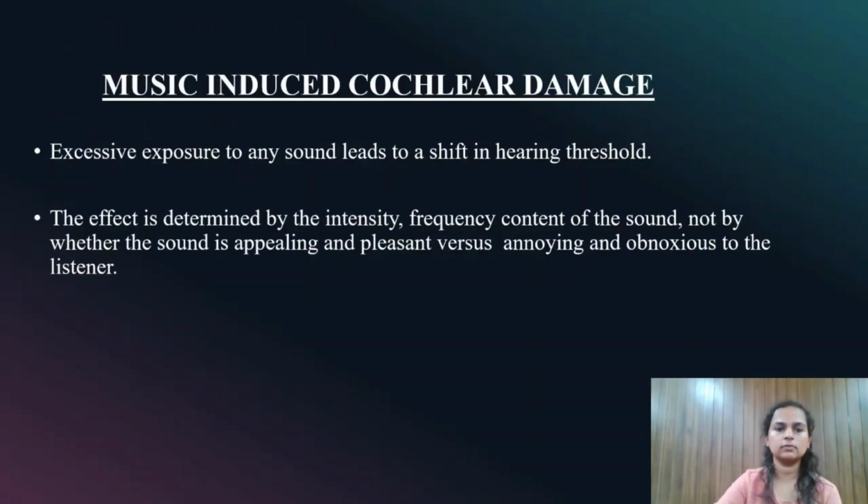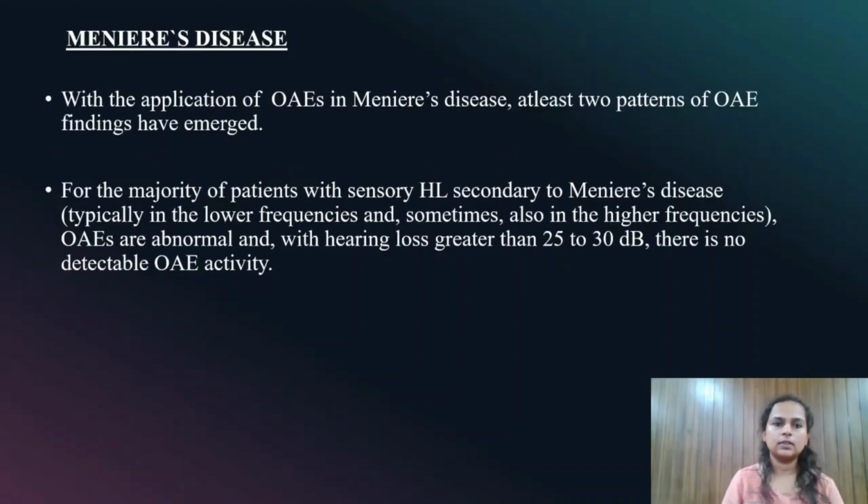Music-induced cochlear damage: excessive exposure to any sound will lead to a shift in hearing threshold regardless of whether the sound is appealing, pleasant, annoying or obnoxious to the listener. In Meniere's disease, we can get two patterns of OAE. In the majority of patients with sensorineural hearing loss due to Meniere's disease, OAEs are abnormal, and with hearing loss greater than 25 to 30 dB, no OAE is detected.